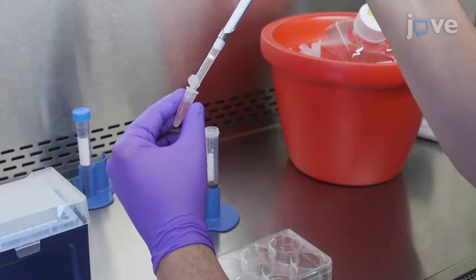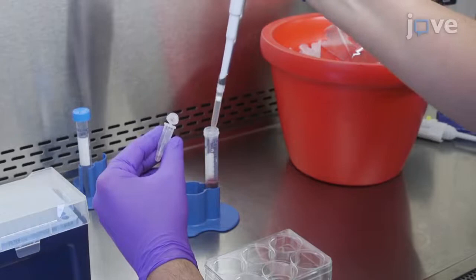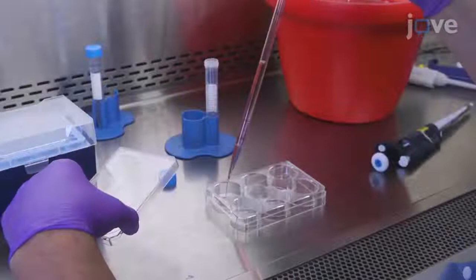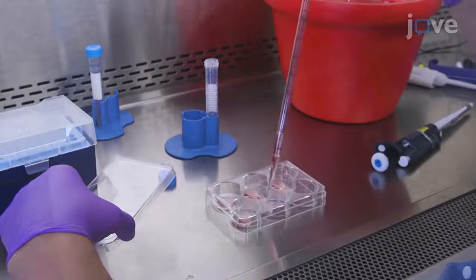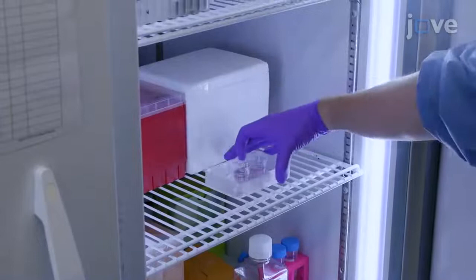To begin, combine 100 microliters of matrix with 5.9 milliliters of ice-cold Dulbecco's Modified Eagle Medium F12 media in a 15 milliliter conical tube. Coat each well in a 6-well plate with 1 milliliter of the membrane matrix. Wrap the plate in paraffin film and store overnight at 4 degrees Celsius.